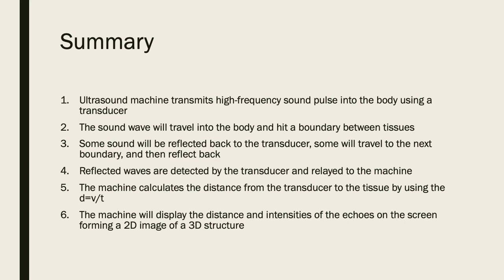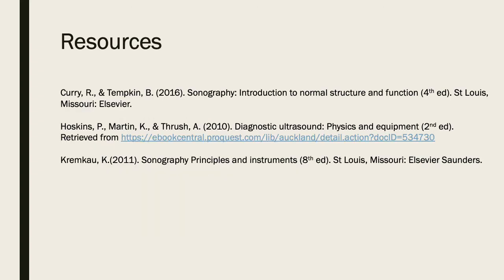The machine will display the distance and the intensities of the echoes on the screen, forming a 2D image of a 3D structure. Other resources that I used in this lecture are right here.